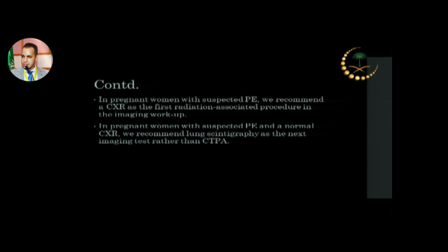In pregnant women with suspected pulmonary embolism, we recommend a chest X-ray as the first radiation-associated procedure in the imaging workup. So if you decide to image the chest, the first radiation-associated procedure recommended is chest X-ray. The value of the chest X-ray is to rule out other pathology that can explain the patient's symptoms, for example, large pleural effusion or infection or congestive heart failure.